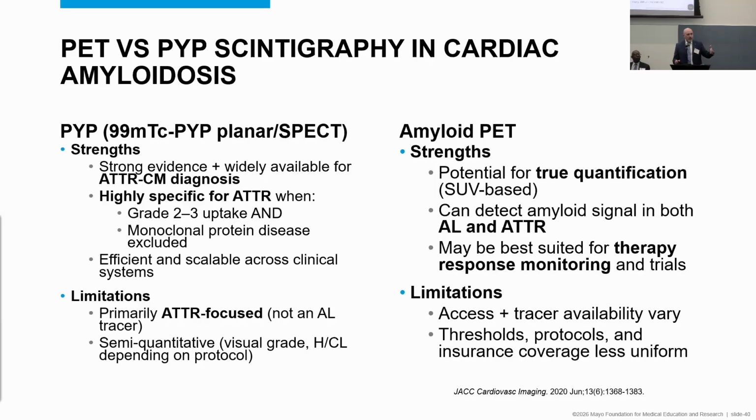It doesn't help for follow-up. Strength of PET, again, it's a true quantification. It can detect both TTR and AL. And again, you can monitor for response to therapy. Limitations: access, cost, and all the other things that we talk about.